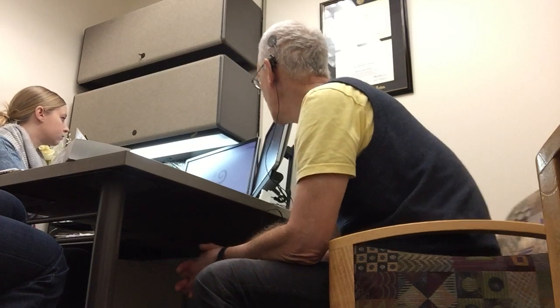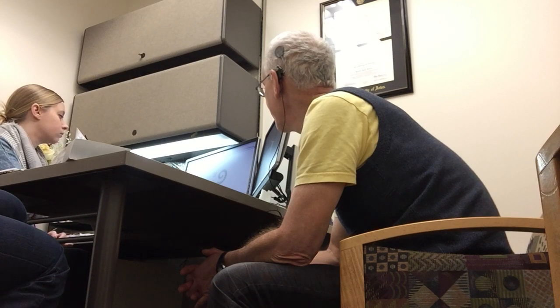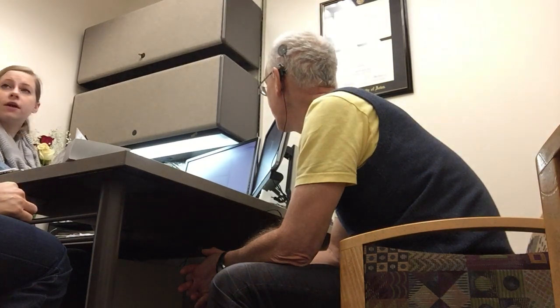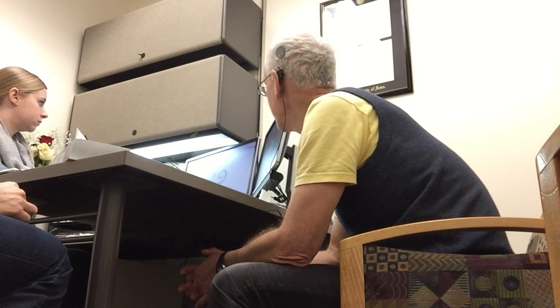Okay. So next what we're going to do is measure the internal device, a setting we can measure from that. You might hear sound, but most likely you won't for this first part, okay? Do you run it twice on activation? Okay. We'll be the same.